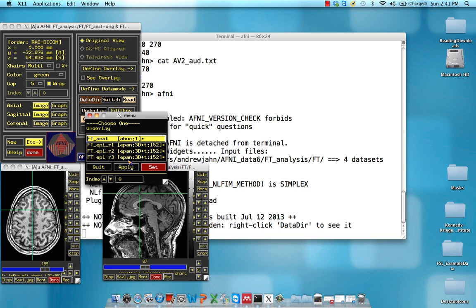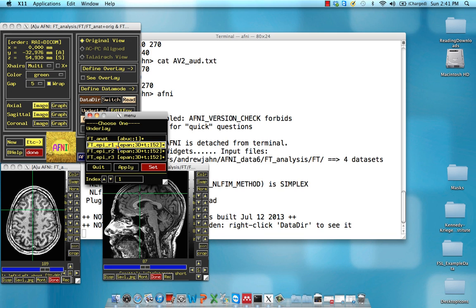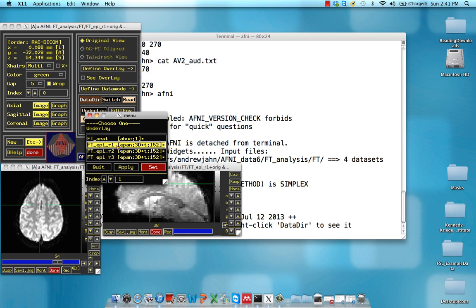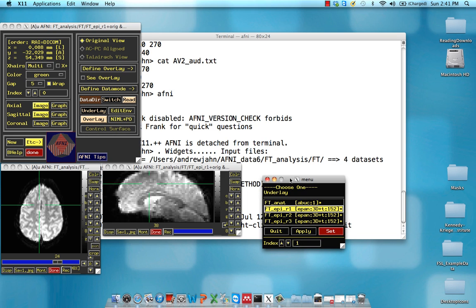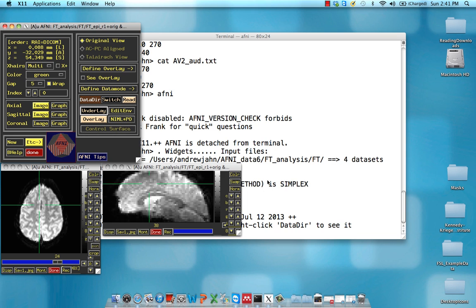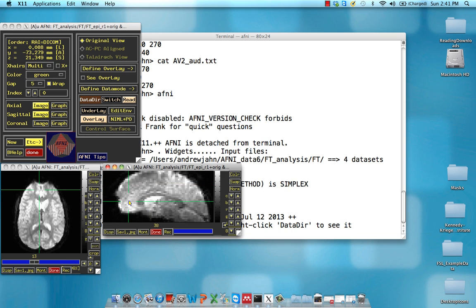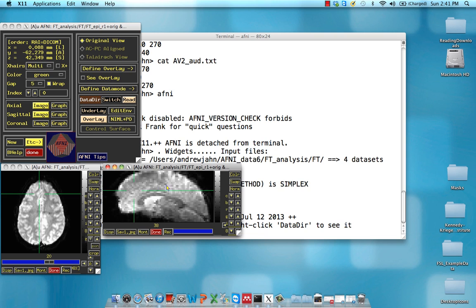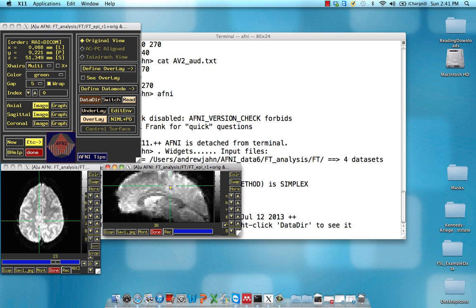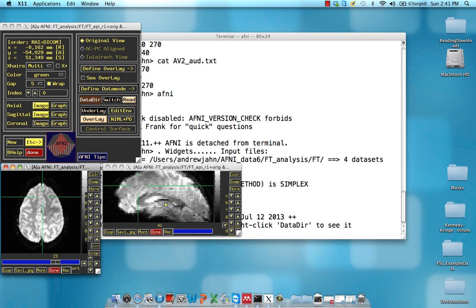If you click on underlay, you can open up each of these functional runs. So that was an anatomical dataset. These are functional runs. Just click around on it, just make sure that it looks relatively clean.